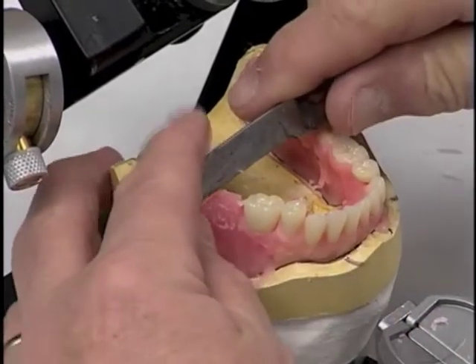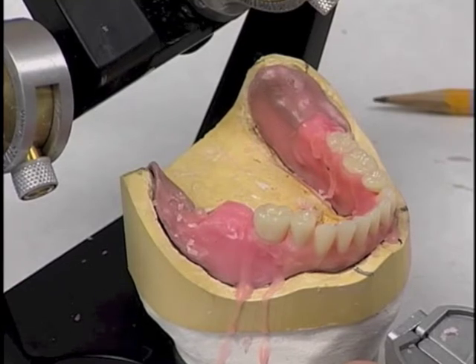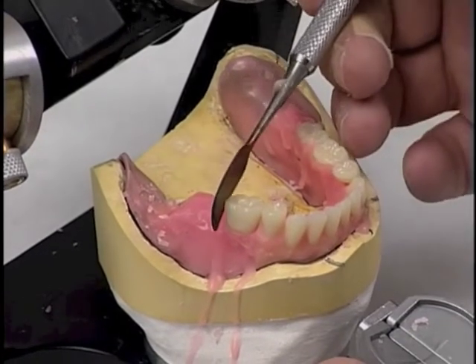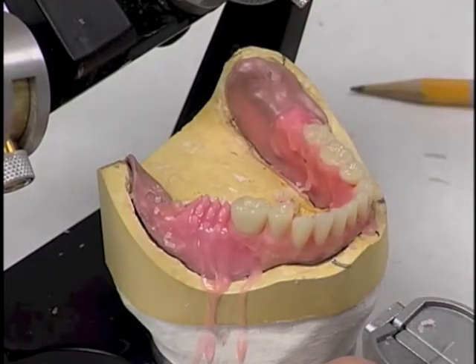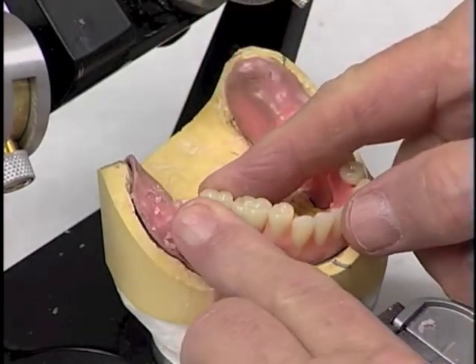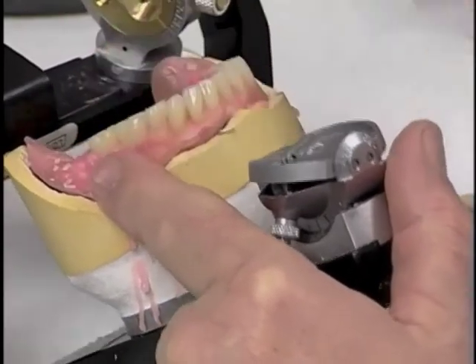Remove a little bit more wax for the second molar on this side. Soften the wax very carefully. Get it soft enough that we can manipulate the tooth into its correct position. And place that second molar now in its correct position, checking it for its buccolingual position and its relationship to the occlusal plane.